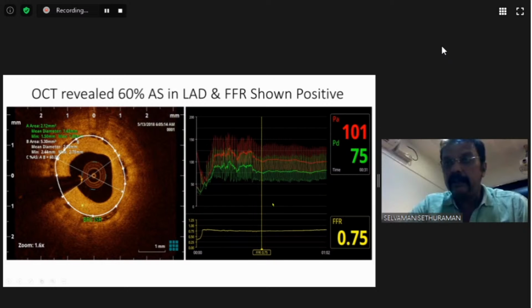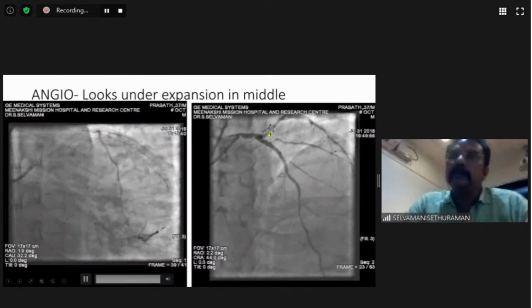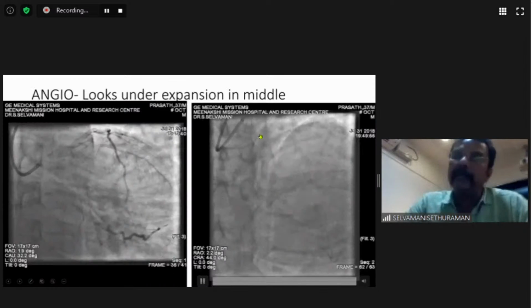So he has a stent. This is the check angiogram 3 hours after thrombolysis after anterior wall MI. 1 year back, LAD stent was put here. So when I did the angiogram it looks like this. So generally what we do for such cases, we say, oh, it is a recanalized vessel. And we ask the patient whether you are taking antiplatelets, or then you reassure and then probably put him on more stronger antiplatelet and send.